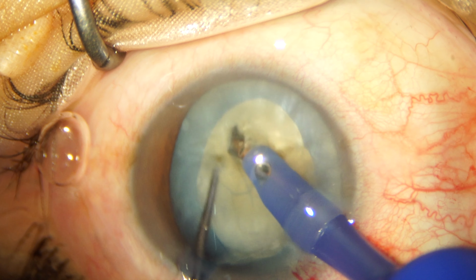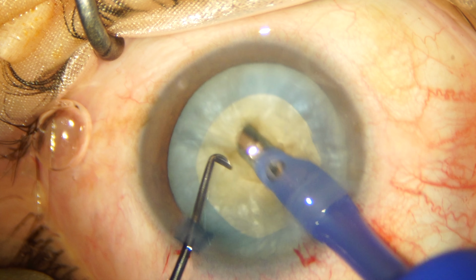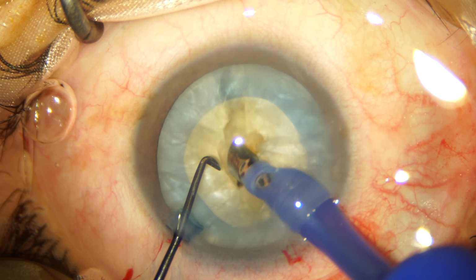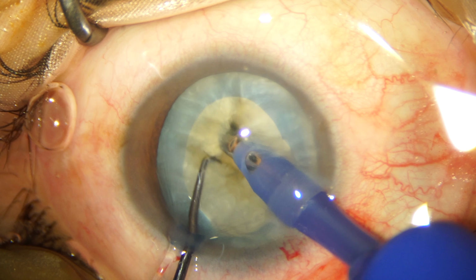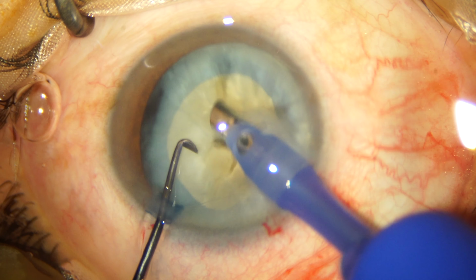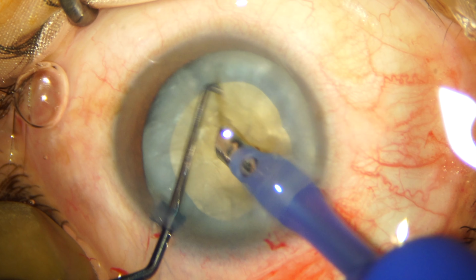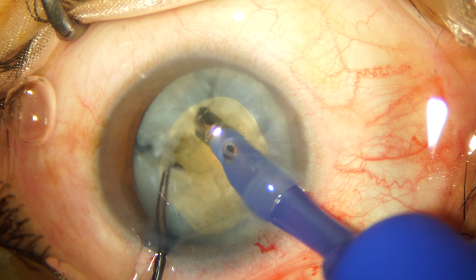I'm successful in getting a second chop or a second separation to create one nuclear fragment, and each of these heminuclei are further fragmented in a similar manner. The lack of epinuclear tissue compromises the stability of this procedure, but nevertheless we have been successful in cracking this nucleus into 5 or 6 smaller fragments, each of which will be now further emulsified.